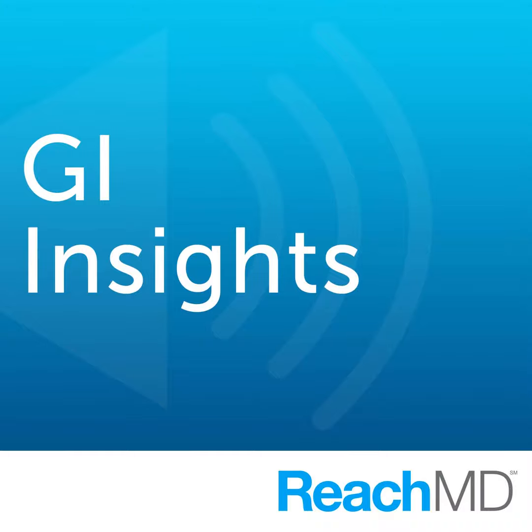Yes, anytime you approach a patient with a stricture, my recommendation is please obtain pre-procedure imaging. If the stricture is less than 3 to 5 centimeters in length, those are the patients you should consider for endotherapy. If they are anastomotic strictures or secondary strictures, they have a high likelihood of responding to endotherapy. But if the strictures are longer in length, or you have a fistula, in those cases I think upfront surgery will help patients much better than us trying endotherapy. This is the kind of algorithm that I follow.